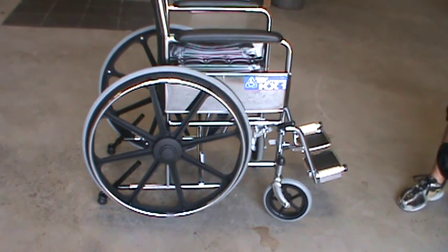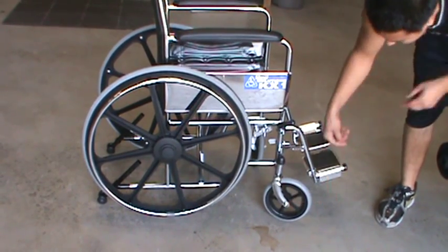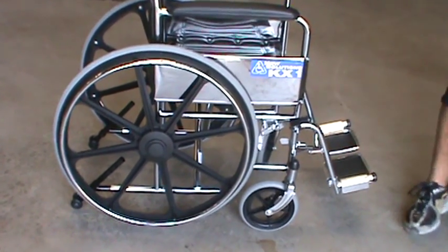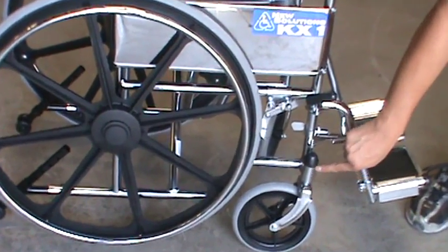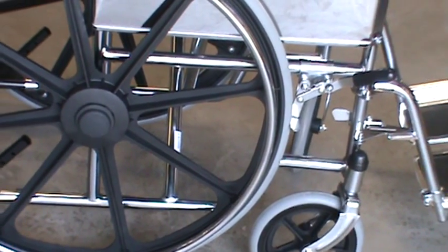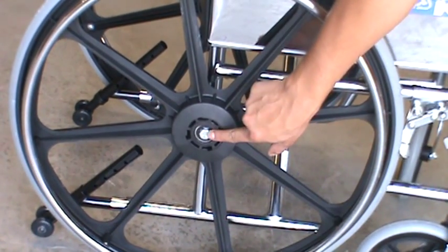There are three locations. One is in the caster wheel — there's a bearing on each side. In the caster fork stem housing, there's a bearing on the bottom and on the top. And in the rear wheels, there's a bearing on the outside and on the inside.